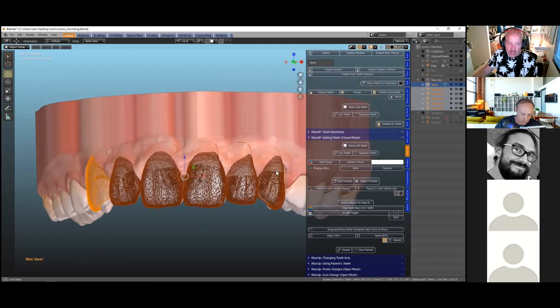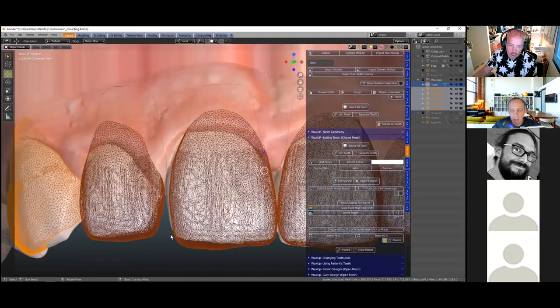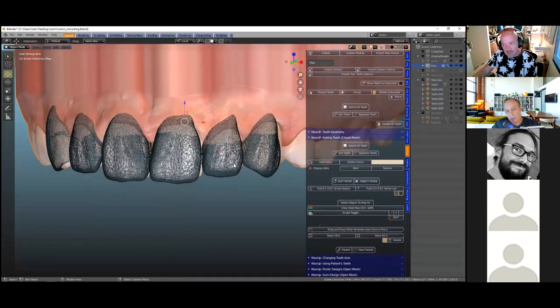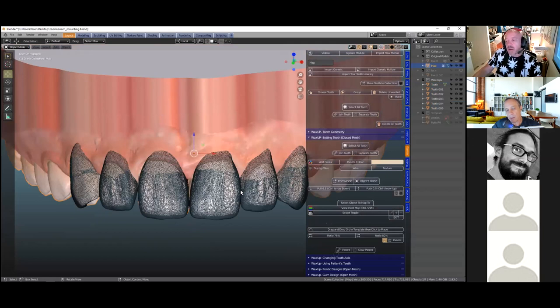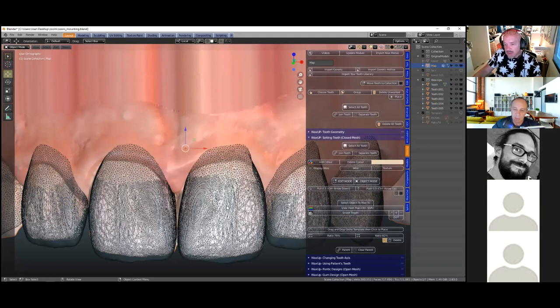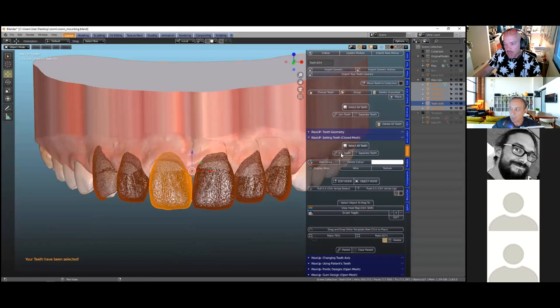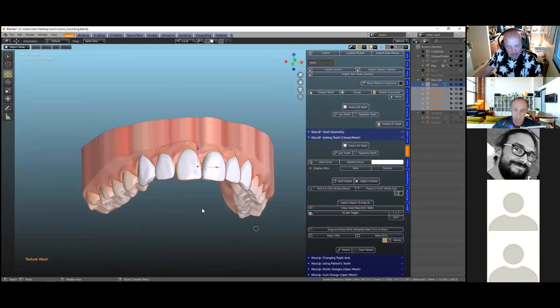We can exit and view in wireframe mode. If we want to hide the 78% stencil, just click on the little window and it disappears. This is a good diagnostic tool to educate a patient — we can explain where we need to add a bit more on a specific tooth, or take off a little edge. These pictures can easily be printed out to show where you might need to prep more, where the gum needs altering, and to get the ideal tooth length. Let's go back into texture mode and select all teeth.